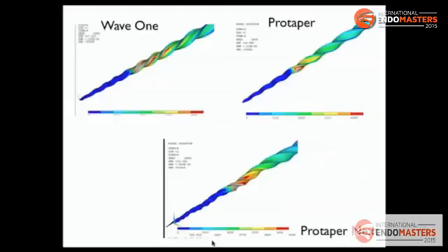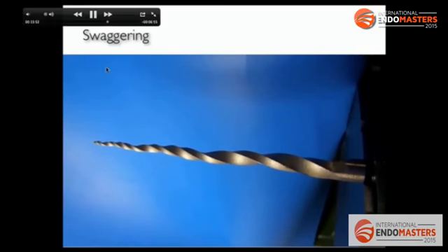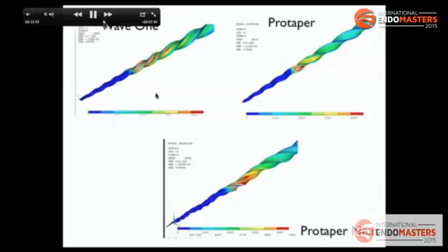So the torsional stress is going to be smaller here, not as small as in ProTaper Universal, but lower than Wave One. In this case, Wave One has a smaller core, a smaller cross section, but the design of ProTaper Next decreases a lot the torsional stress because of the point contact it has. It contacts just in a few points, not in all the part of the file. So in my opinion, it's a great design because it's balanced in flexibility, balanced in cyclic fatigue, balanced in torsional stress. In my opinion, it's the first design balanced in all the aspects of metallurgy.